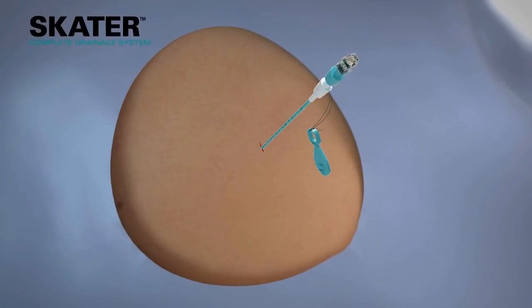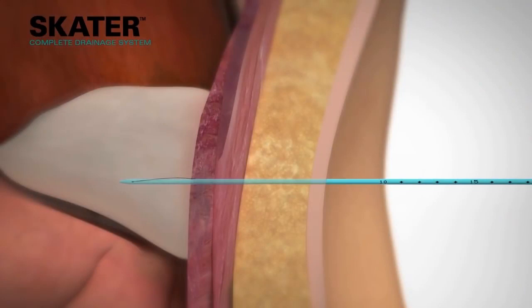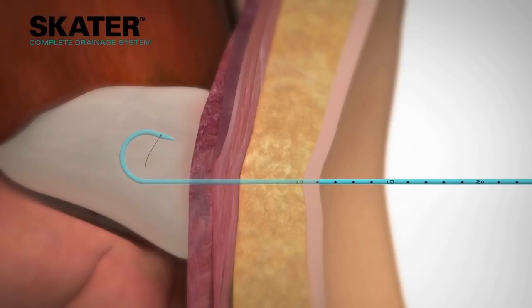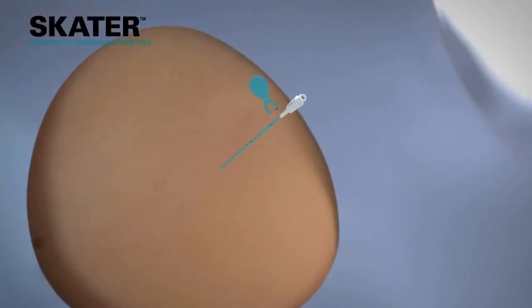After the catheter is positioned, the cannula is unlocked from the catheter hub. Holding the cannula stationary, the catheter is advanced further into the body to the desired location, ensuring that the pigtail is in the cavity. Then the cannula is fully removed.